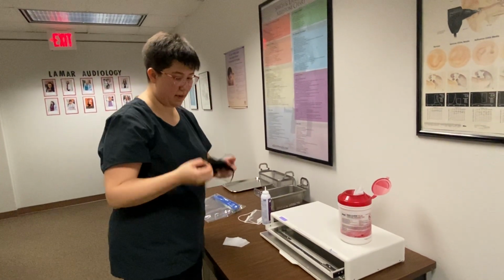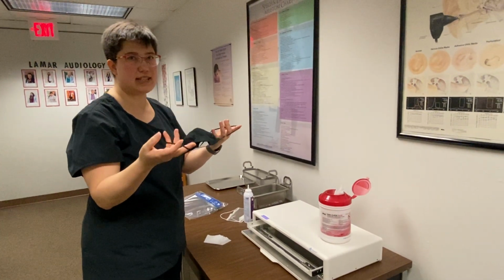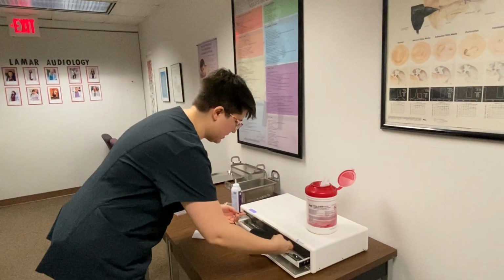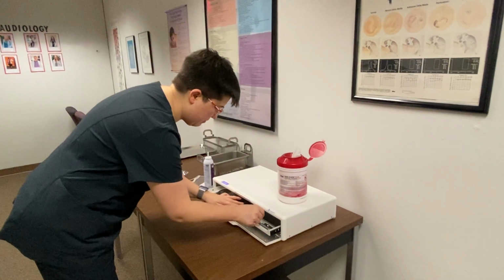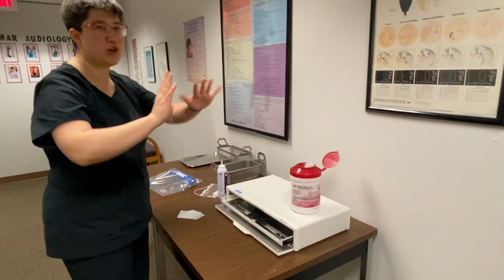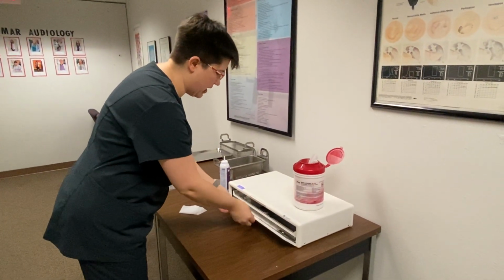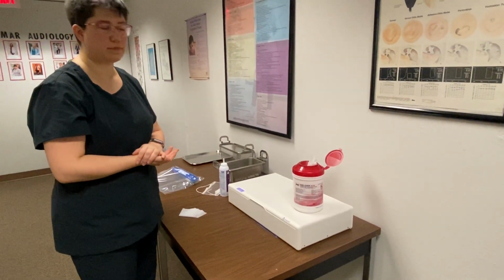So fabric masks, the big thing is that you need to have the straps spread out, and you put it in carefully because it's not quite tall enough for how much of them there is. You don't want any folds if you can help it. And again, it starts when you shut it and it runs. Perfect.